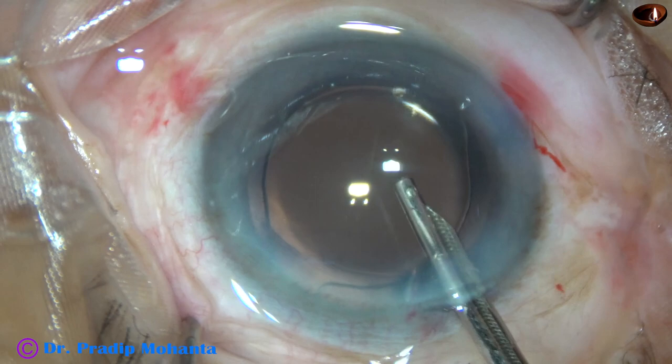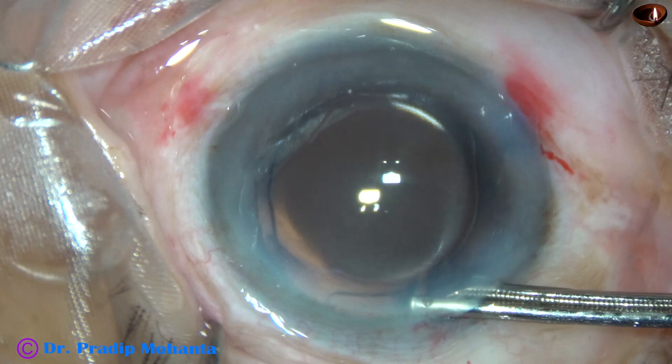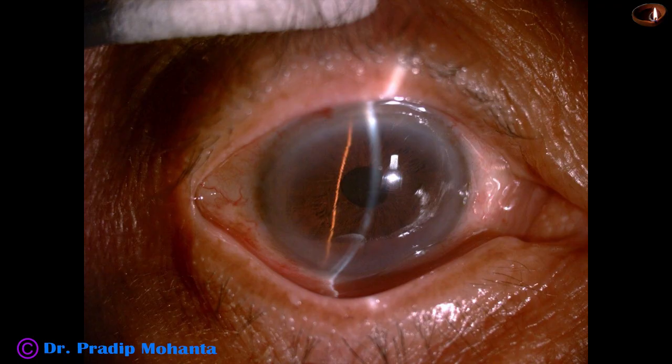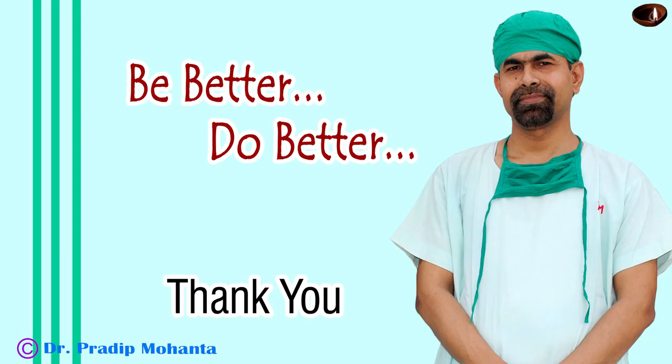The side ports are closed and now a final lavage of the anterior chamber — any visco sticking to the corneal endothelium is removed. The anterior chamber is formed very nicely and the case is concluded. I have some postoperative pictures taken 18 hours after surgery. The cornea is clear, anterior chamber is quiet, intraocular pressure is 14mm of mercury, and unaided vision is 6/12. The patient is very happy and I am happy because the cornea is so clear, though I used only HPMC as the viscoelastic substance. Thank you very much for your attention. Hope this video will help you in developing your surgical skills. Be a great surgeon — always put yourself into challenging situations to increase your surgical skills.